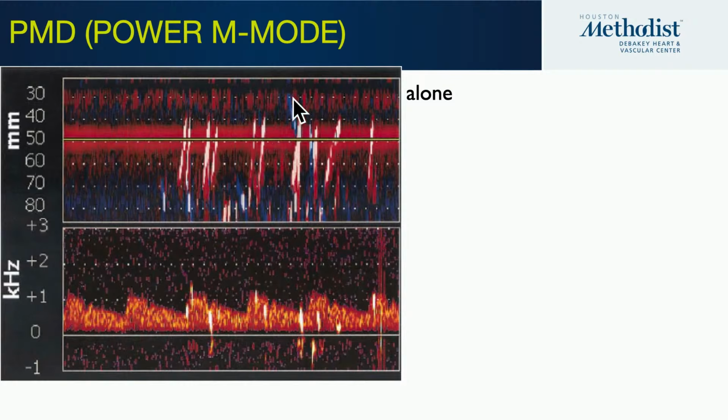This is a weird one. This blue one doesn't have a tail coming in from the MCA. This may be a representation that this signal is coming into the ECA and getting into the meningeal branches. That's why you have a blue signal in front of that red signal. So when the blue signal doesn't have anything in front of it, that means it did not come through this MCA. That blue signal is really coming from the ACA.